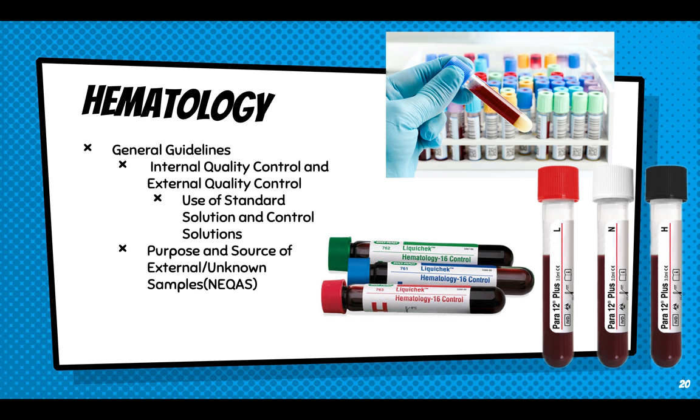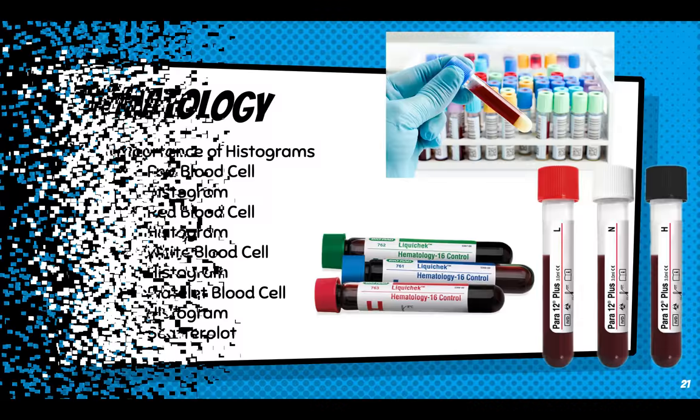3, 2, 1, and the answer would be your K2 EDTA or your dipotassium EDTA. Correct. I hope you're getting it correct. Okay. So, for the hematology, what we will be discussing more are actually your histograms.